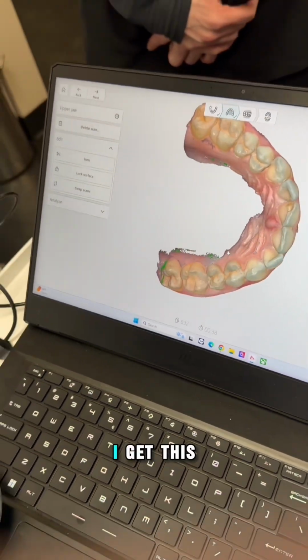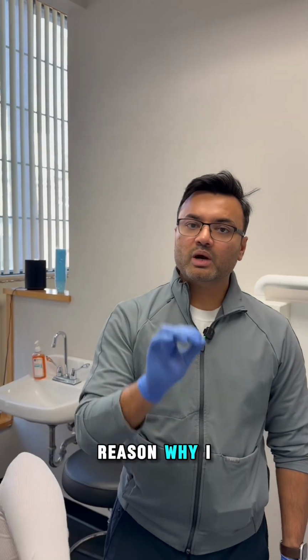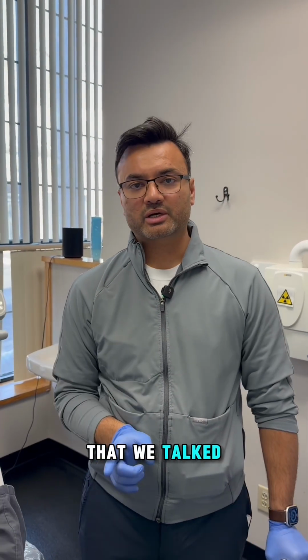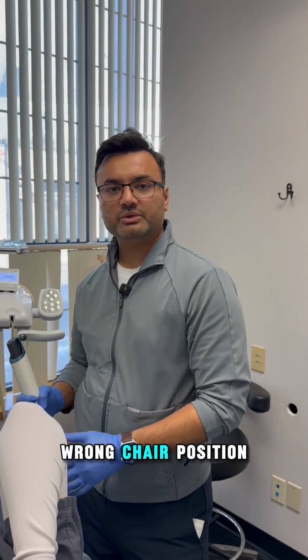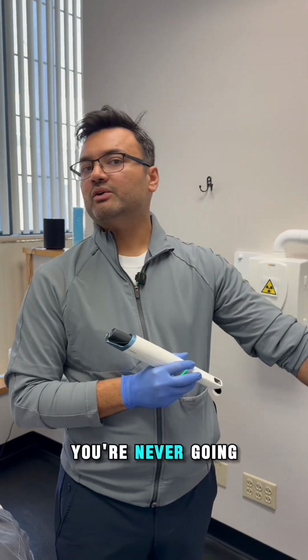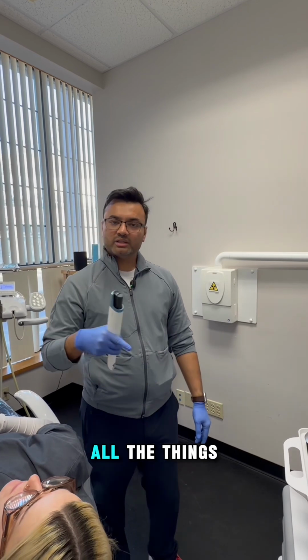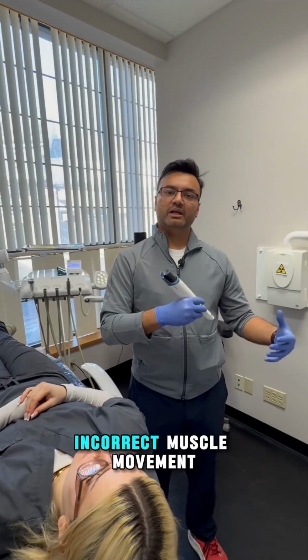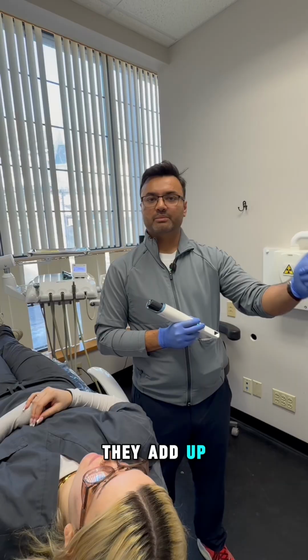So I get this all the time from my assistants or whoever I'm teaching, that you do it so fast. And I'll always say one thing, that the reason why I do it fast is because before I scan, I'm focusing on all the basic stuff that we talked about. Only then you'll be able to go this fast. You have the patient in the wrong chair position, you're holding things incorrect, you're never going to get this speed, because it has nothing to do with how fast I'm scanning. All the things that slowed me down played a role. Incorrect chair position, incorrect accessibility, incorrect muscle movement, incorrect retraction.